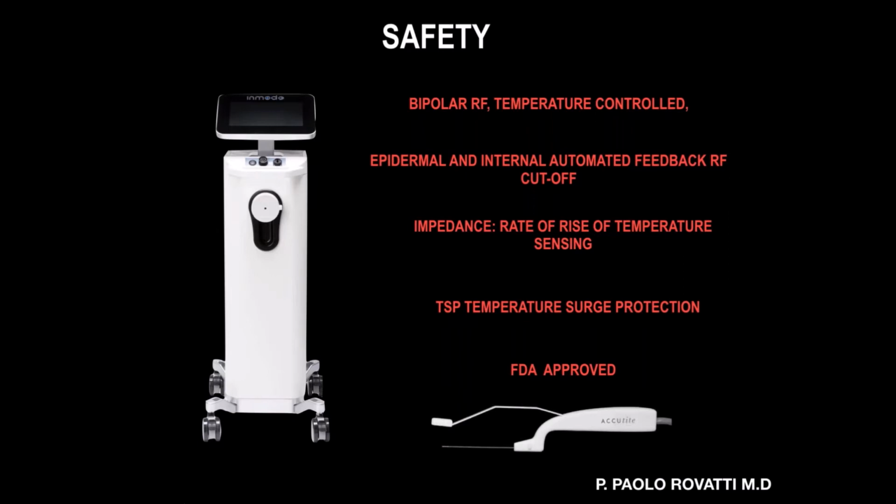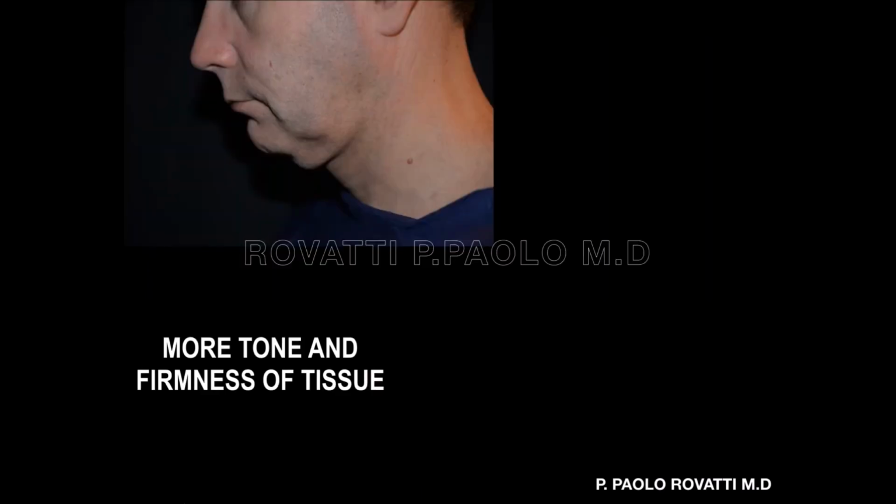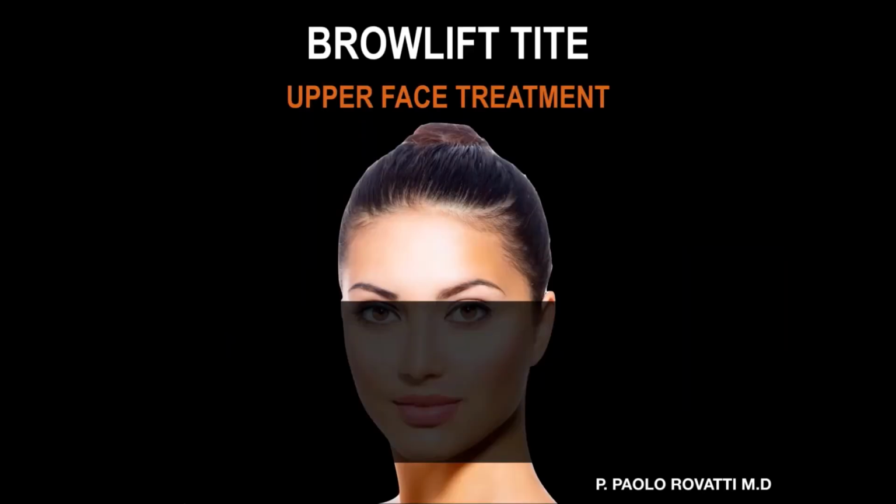Less downtime. This is 1 week after. You can see the red on the neck, the red pins, just like Morpheus, like fractional. So they usually stay a week, 10 days. So after a week, the patients can go out. Or we have more tone. This man, we have more tone and firmness of the tissue that I want to show you just by bending the neck. So we don't have all the amount of skin because we reduced the length of the tissue, and we have a contraction of the tissue, and we have production of collagen, so that the tissue is more toned.